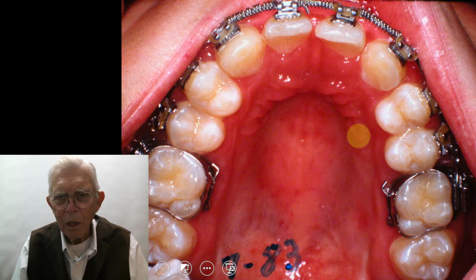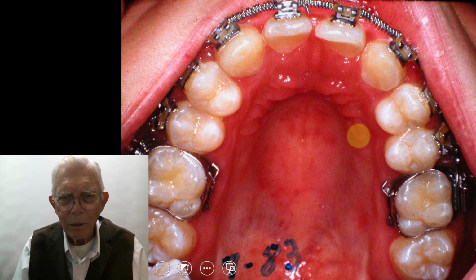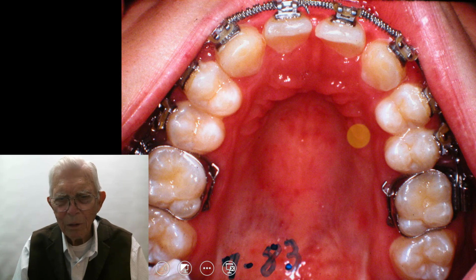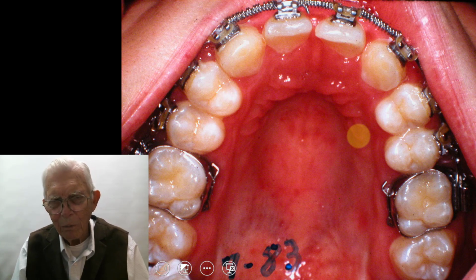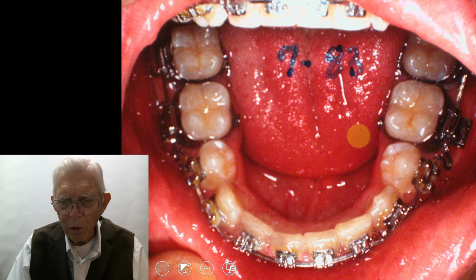Now you could come back in, and we had him almost together up there. It looked pretty good, but the cuspids don't look too good. His laterals are as big as the centrals almost, but that might be better than having two implants or a bridge running across there. The appearance could be better than it is here. So let's see, this is 1983, and the lower teeth are lined up.